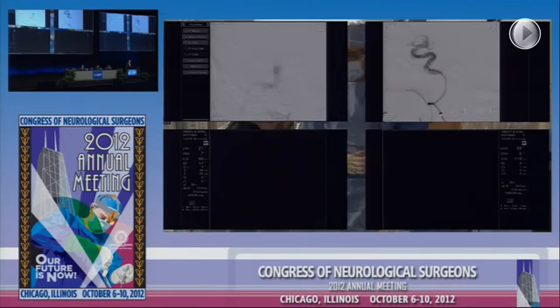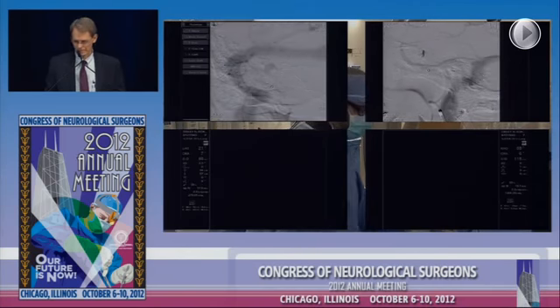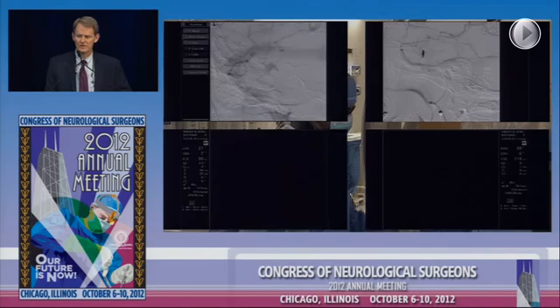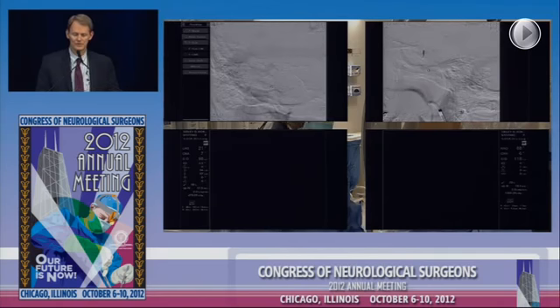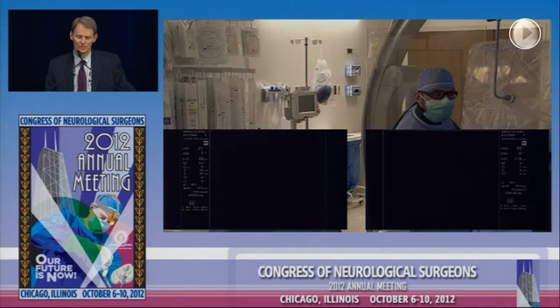So bottom line is, this is a procedure that, is it perfect yet? No, but I think it's a nice advance. This was an aneurysm that had about a 6-millimeter neck, and it was just about 14 millimeters in the largest diameter. And one stent and about a 30-minute procedure total has probably cured this patient. And I think that if we do have to do more, we can do it. The likelihood is this is going to take care of it. And it'll thrombose slowly. There's very little risk of rupture because it's never ruptured before.